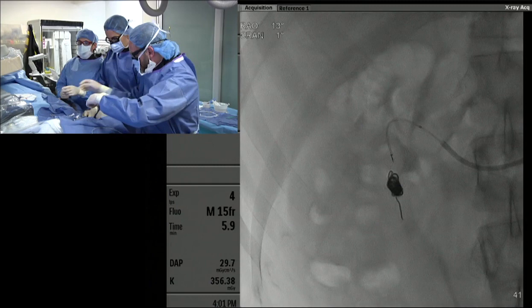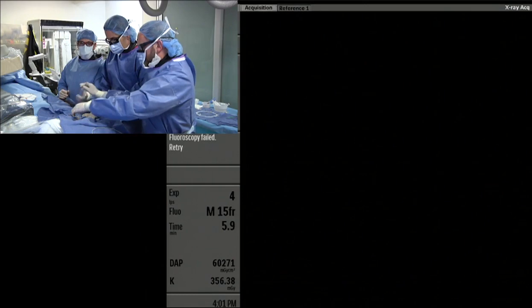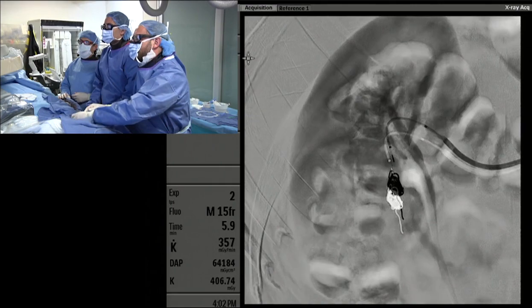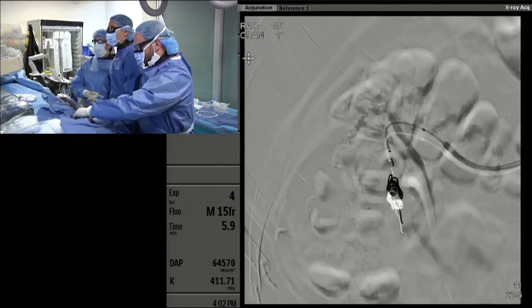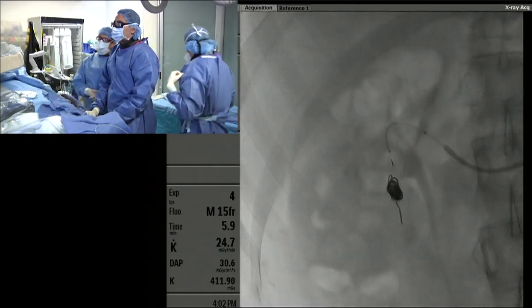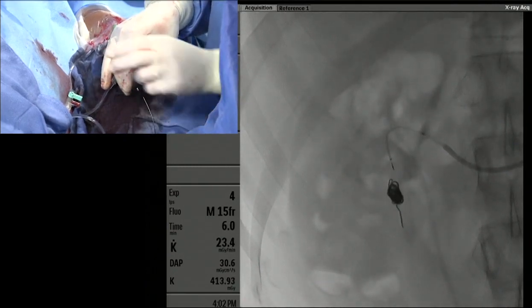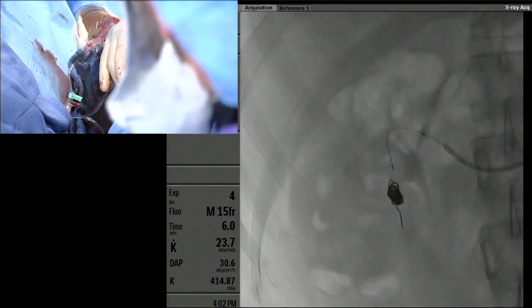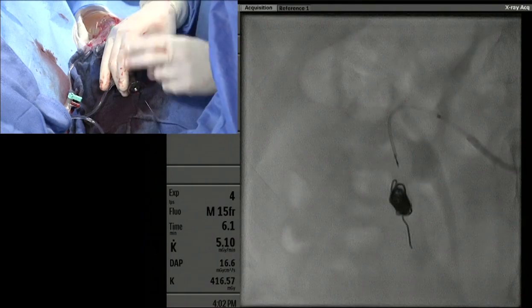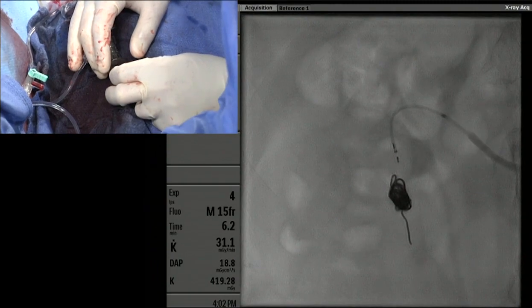The device is right there. We can also do a run through the guide, and we'll get a good sense of whether this is actually occlusive or not before we do that. We're going to give it a couple twists, and it should detach and pop off right now. See if you guys can see the fluoro. It's still attached. Hold on. We'll zoom in a little bit for you. There it goes. See how it popped off?